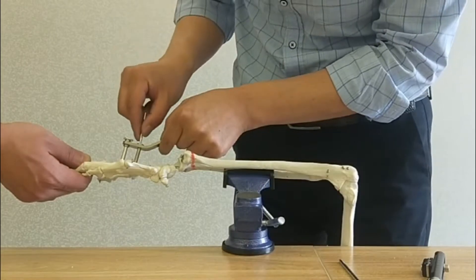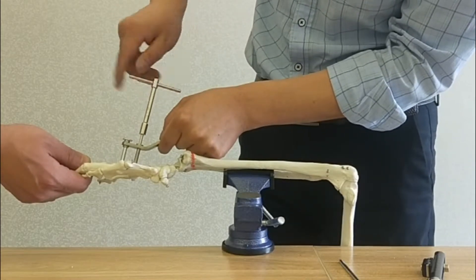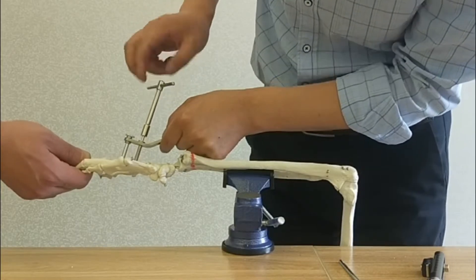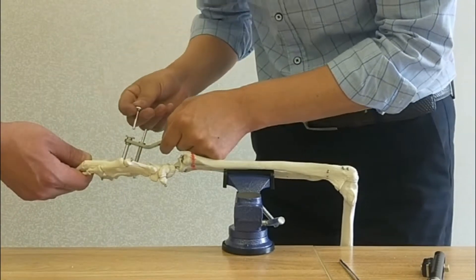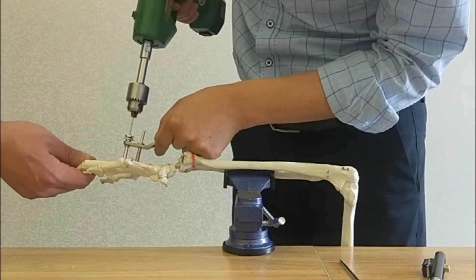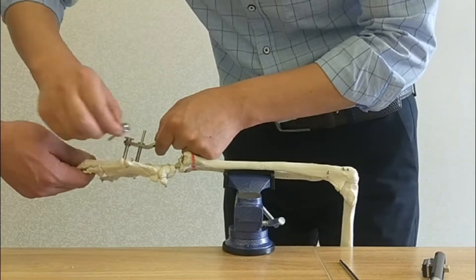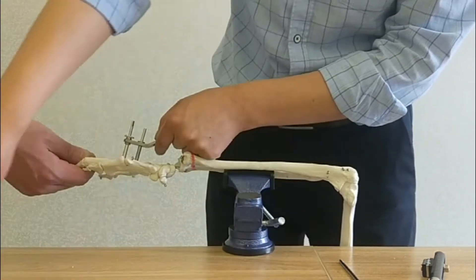Take out the inner sleeve and then insert the first screw. Use the screwdriver. Then the second screw — put in the inner sleeve first and then drill the hole. The second screw.